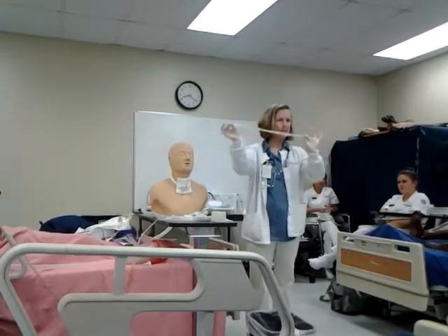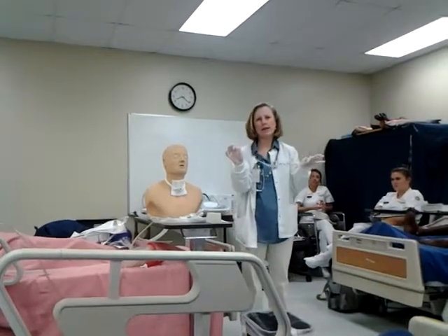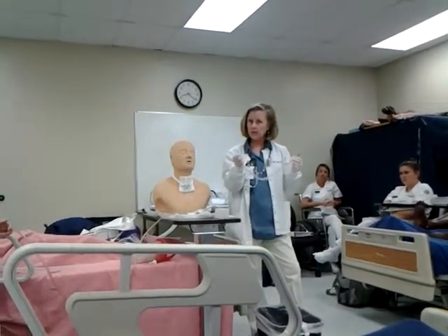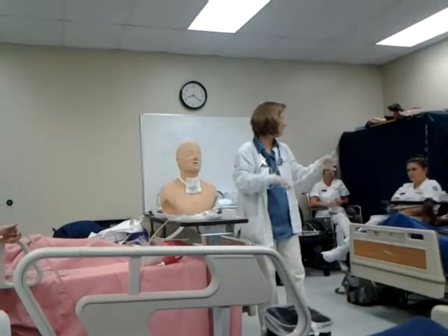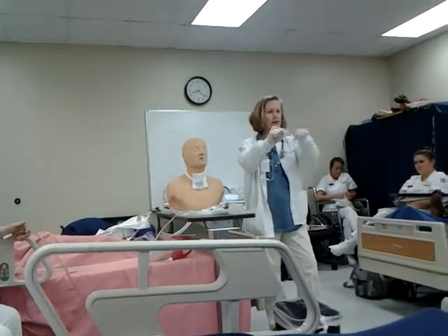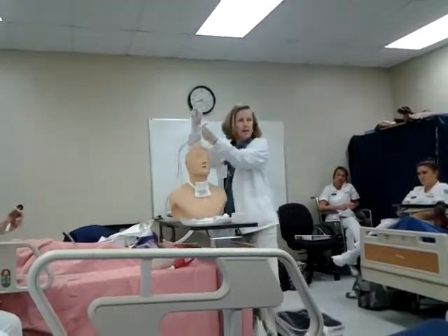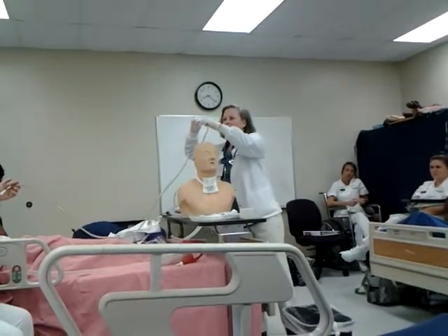This one has a plastic sleeve on it. Yours does not have a plastic sleeve on it. I'll talk about that later. Okay, the purpose of that. When we're doing this procedure, you're going to keep your dominant hand sterile and your non-dominant hand is going to be contaminated. So I'm going to take my catheter, I'm going to roll it up in my hand. Now, this is all sterile. I'm now going to take my non-dominant hand, which is hooked up to the tubing, to the canister, and I'm going to connect.